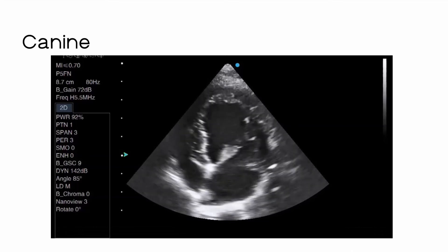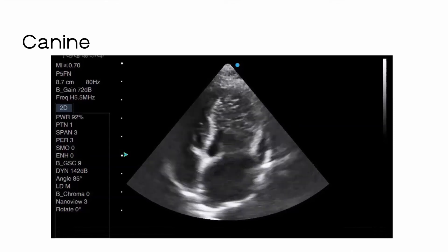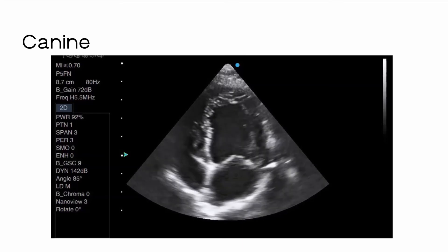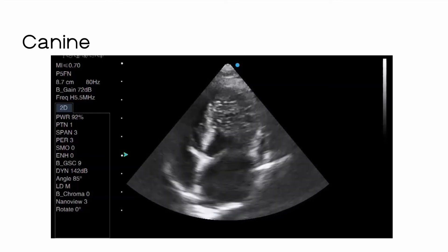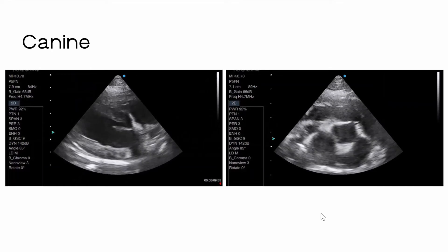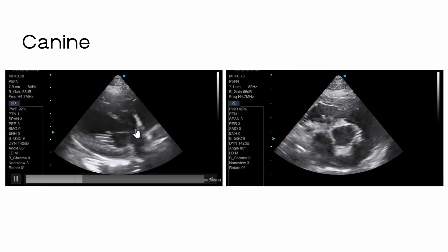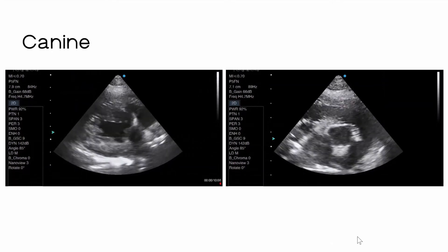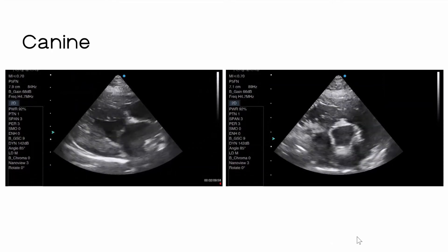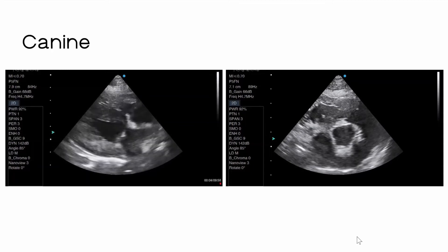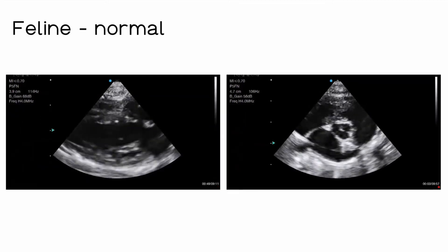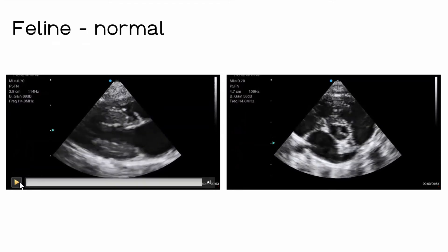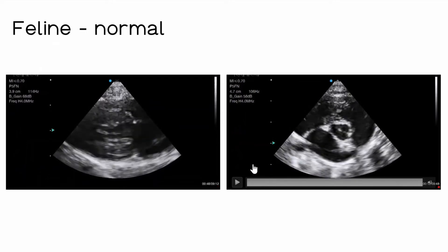Sometimes you can get unconventional views — you can put your probe on things not as you expected them to be. By working out what you're looking at, you can usually correct your view rather than getting frustrated. So let's focus a bit more on the left atrium now. Here it is again in the long axis, and here you have the left atrium in its short axis — it's a 90 degree twist and a little bit of a cranial tilt, and I'll show you that in a moment. And here is an example in a cat, just getting used to what normal looks like.